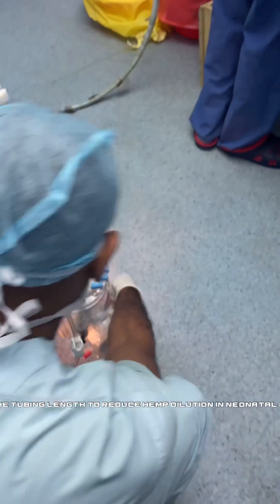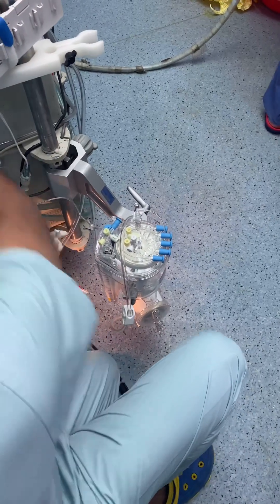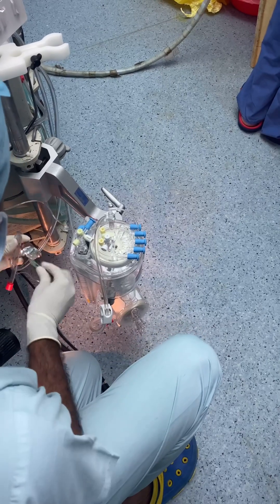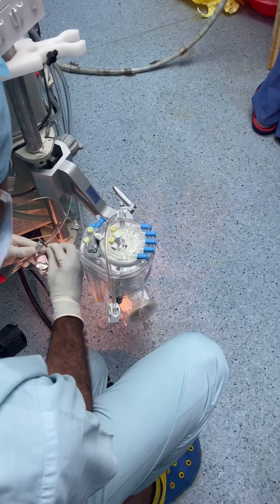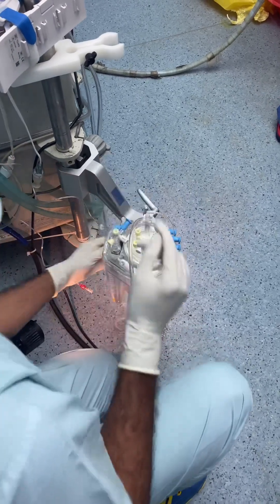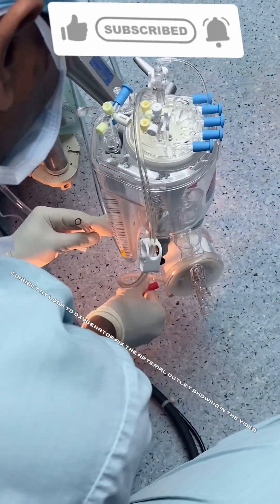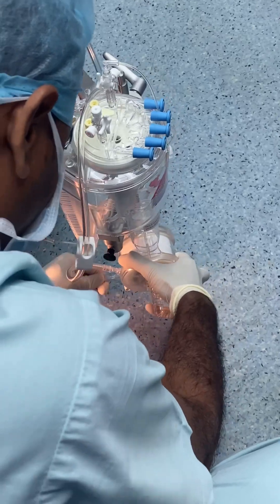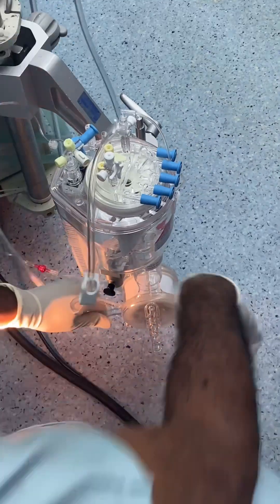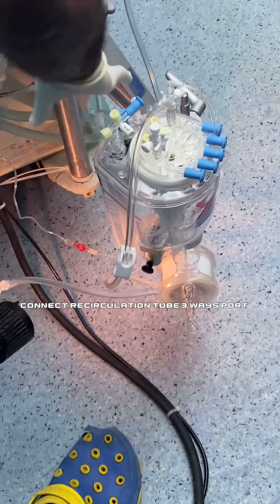Cut the tubing length to reduce hemo-dilution in neonatal cases. Connect the AV loop to the oxygenator and fix the arterial outlet as shown in the video. Connect recirculation to three ways port.